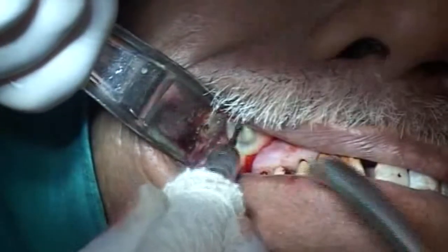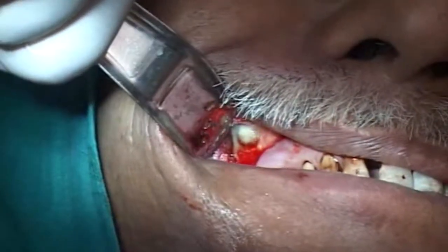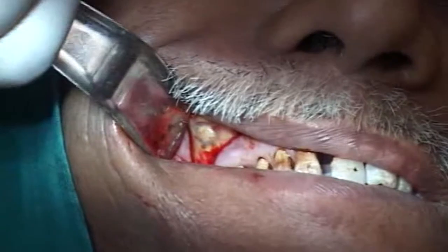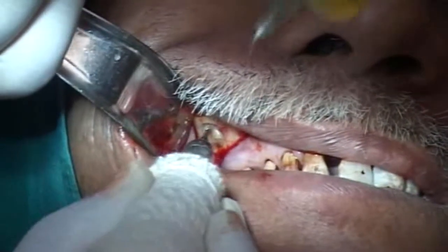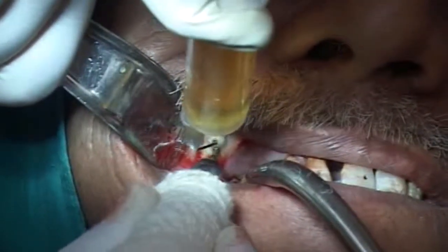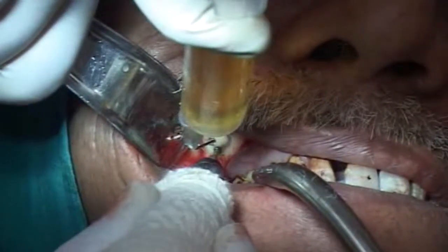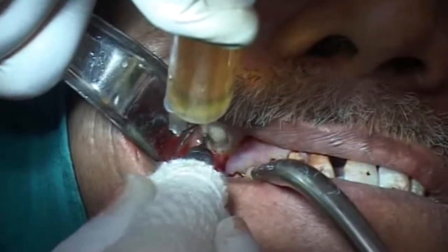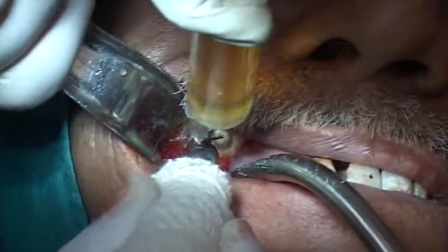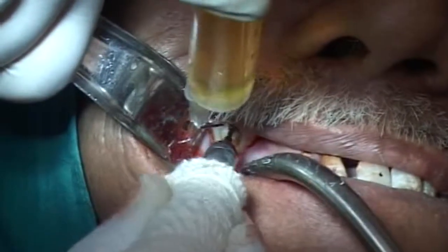With a very gentle and loving shaving motion, the marking is deepened, and as you see, the gray area becomes darker and darker as we reach near the maxillary sinus lining. By no means do we want to completely perforate with the burr, but as the gray area becomes deeper, we just want to leave a thin bony margin which can be fractured by a blunt instrument.